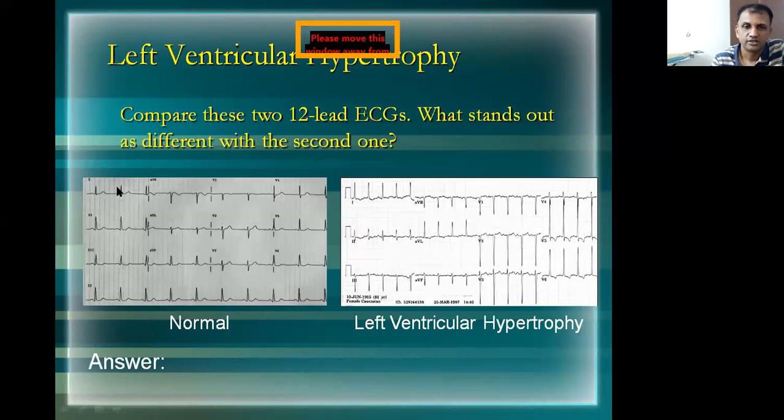If you look at this left ECG, the left trace is a normal looking ECG. Because if you remember, like I told you the other day, from V1 to V6, the chest leads, your QRS should gradually grow taller. It should start smaller, like a child, and like they grow gradually with each passing year, they get taller until a stage. Like that you should get. This is a normal ECG.